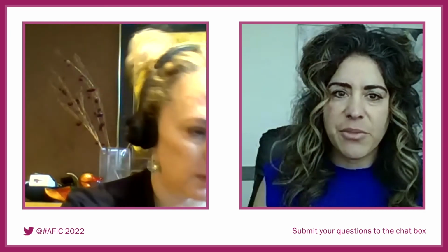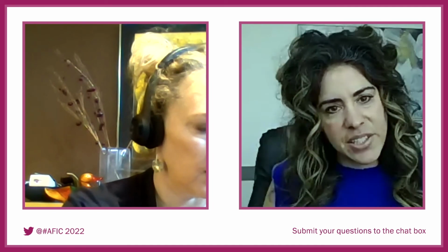But really, the Qscan has come a long way with our machines, and they're correcting for a lot of that. So yes, it's good to know things and to have a list of how those things work, if you don't have Qscan on your machine or are unaware where it is. But I think technology has come a very long way, and to be able to utilize that right off the bat, it's very easy and very efficient.